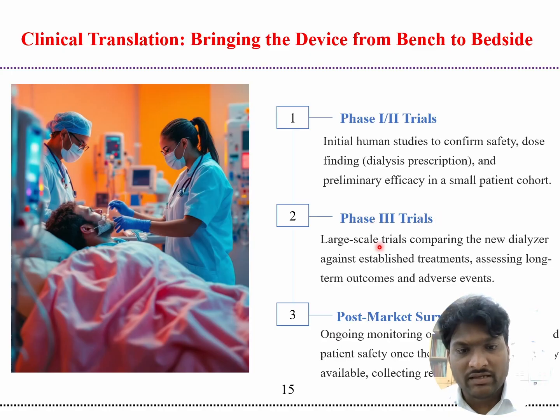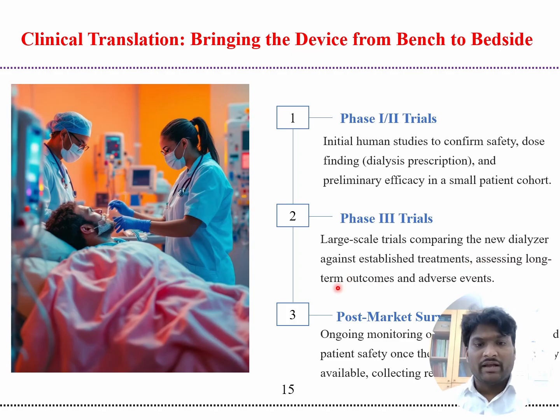Phase 3 are large scale trials comparing the new dialyzer against the established treatment, assessing long term outcomes and adverse events. And post market surveillance monitors ongoing patient safety in the market.